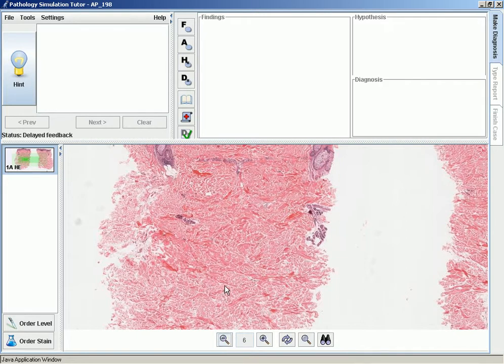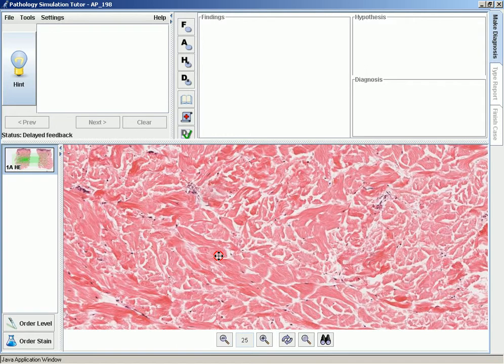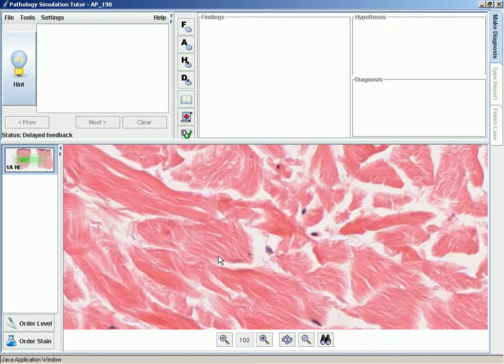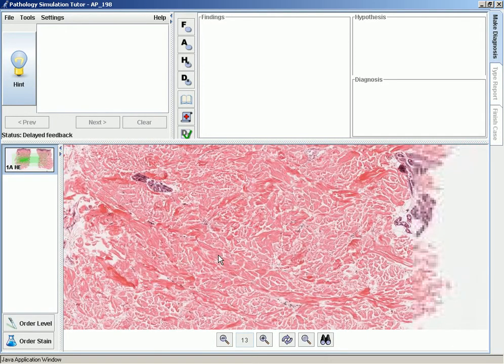You can also zoom in and out when your mouse is over the image itself by just regular left and right clicking your mouse. To zoom in, simply left click your mouse. Every time you click will zoom you in at power. And to zoom out, simply right click your mouse. Again, every time you click, that will zoom you out of power.